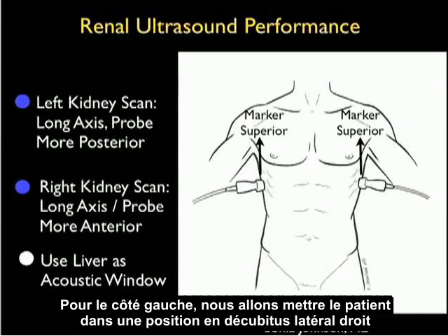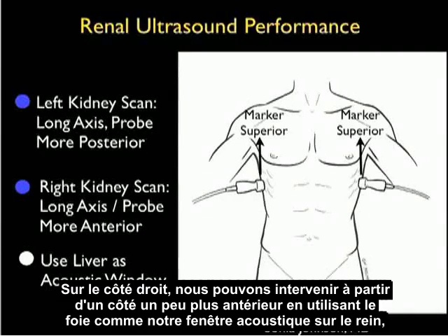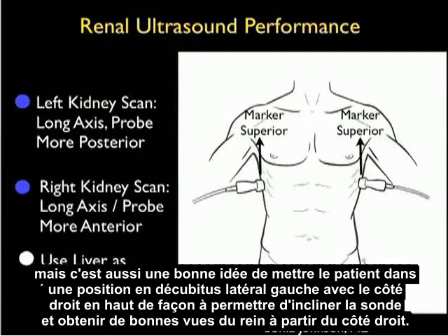For the left side, we want to put the patient in the right lateral decubitus position with the left side up so we can come in from that posterior position and image the kidney. On the right side, we can come in from a little bit more anterior using the liver as our acoustic window onto the kidney, but it's also a good idea to put the patient in the left lateral decubitus position with the right side up so that we can angle the probe and get good views of the kidney.